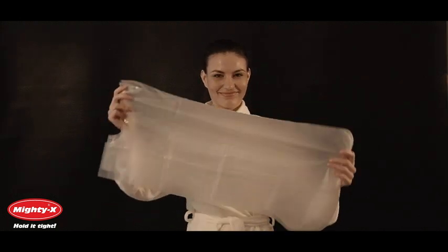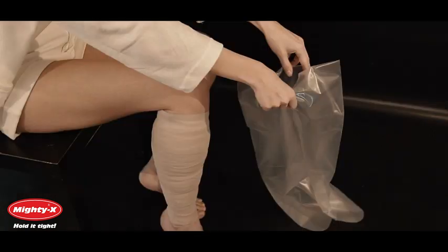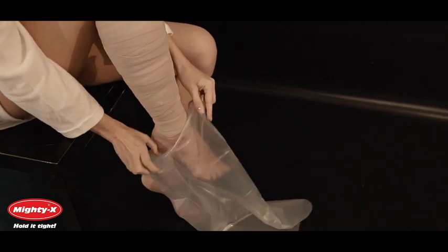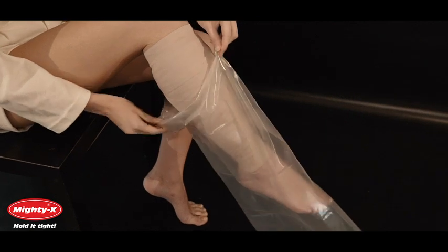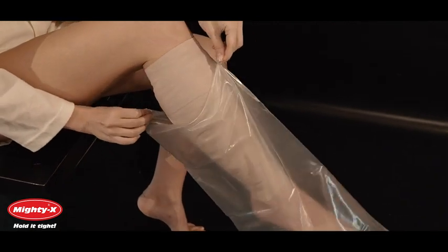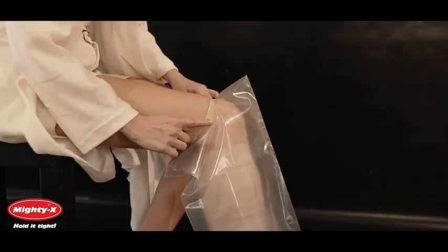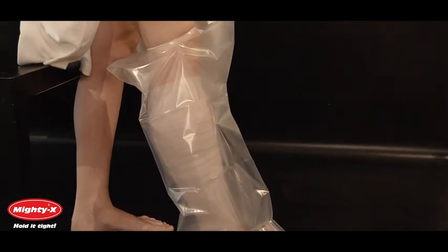Mighty X Cast Covers are designed to fit adult legs and are not suitable for children. Carefully pull the cover up by the corners as high as it will go up on your leg. Be sure to use uniform tension on its corners when putting it on. Smoothing the seal all the way around creates a plastic band that should be visible on your skin. Pull back down slightly to complete the seal. Make sure that your cast or bandage is fully covered and the seal fits snugly on your skin.